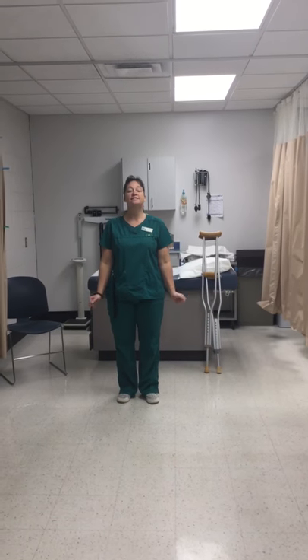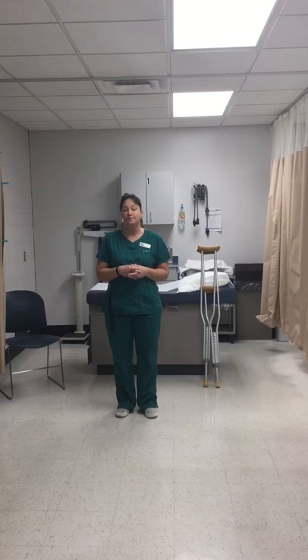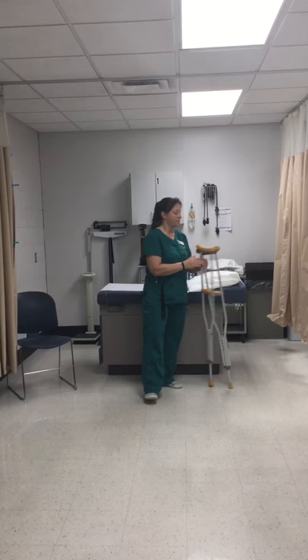This is the video competency for crutch teaching. Step one, like all the others, is to do a medical aseptic hand wash and to gather your equipment. You will go to the other room, do a hand wash, and the equipment you need to gather for this competency is a set of crutches.